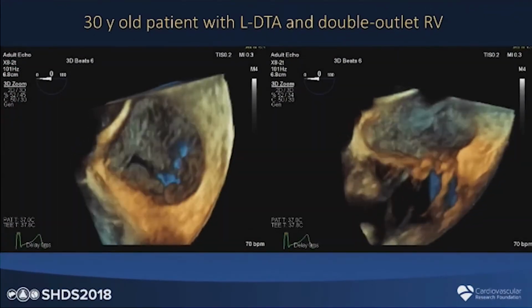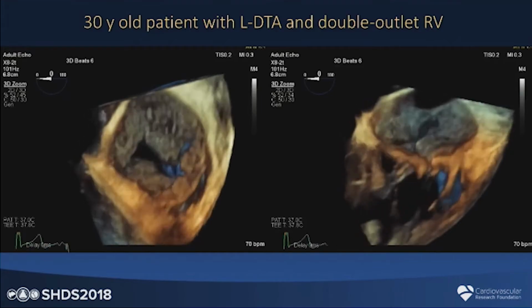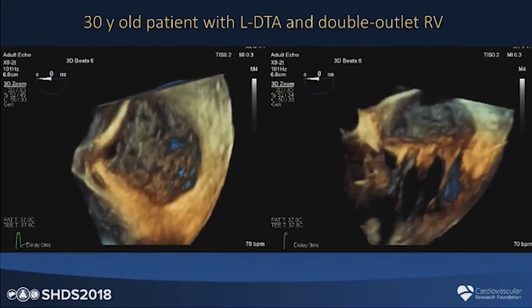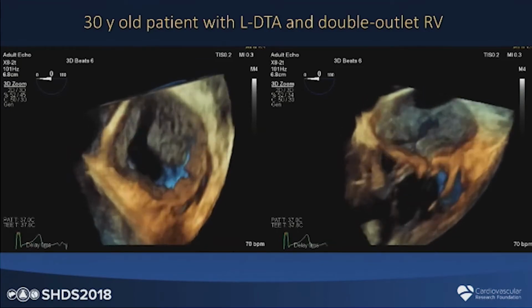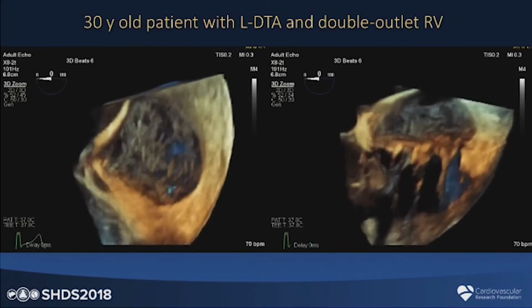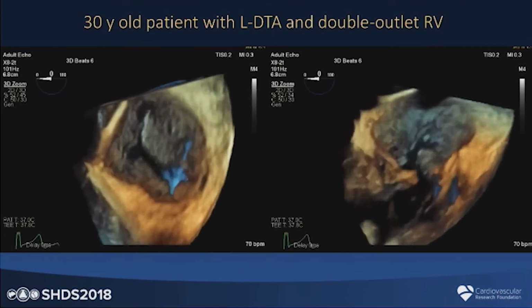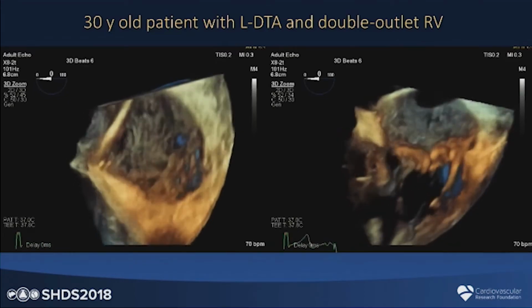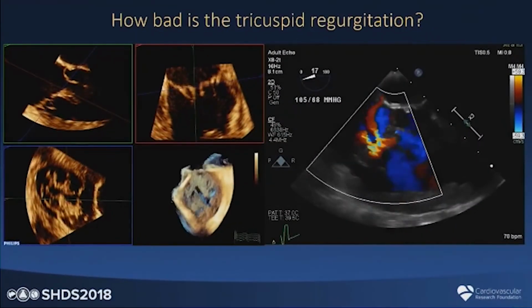That's the more functional type. Here's a congenital case of a very interesting patient that we considered for MitraClip, and eventually we shied away from treating her, and admittedly under anesthesia her TR wasn't as bad. But you see this ginormous tricuspid valve that imaged really well. You see the chordal apparatus at the bottom, just to share how variable 3D imaging of the tricuspid valve may look.